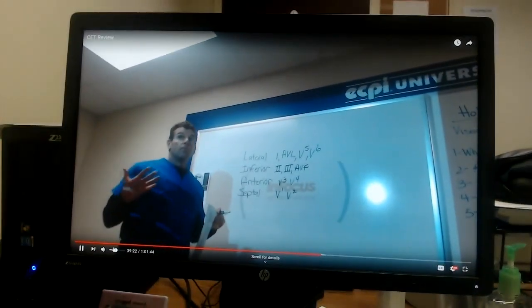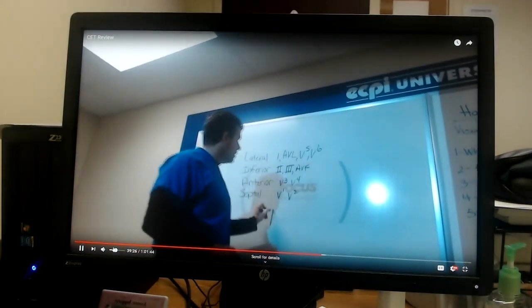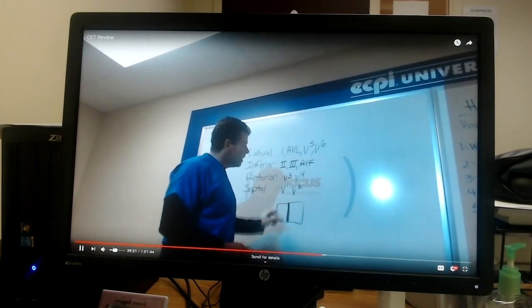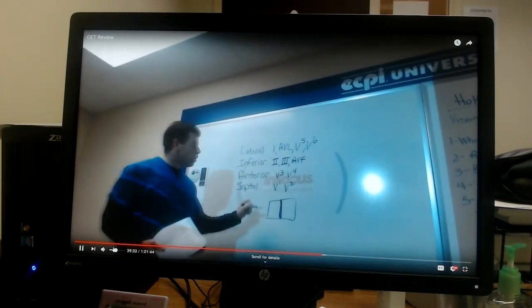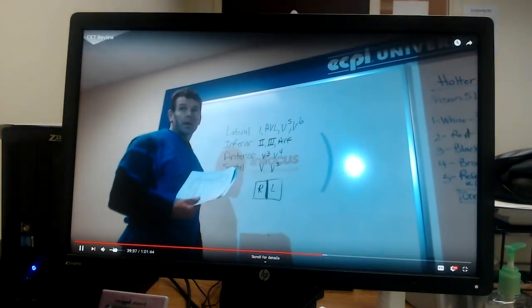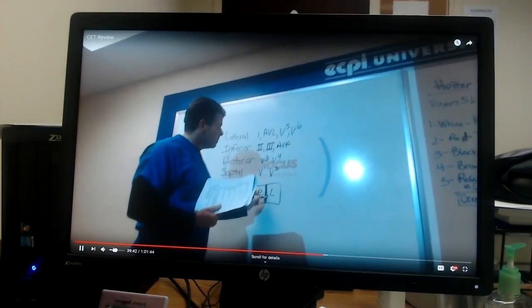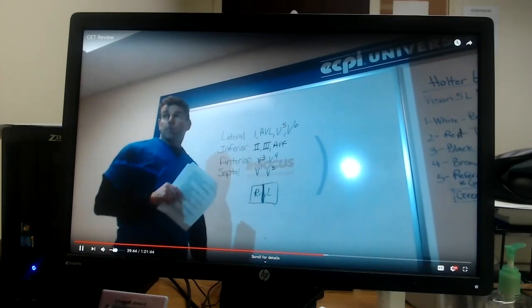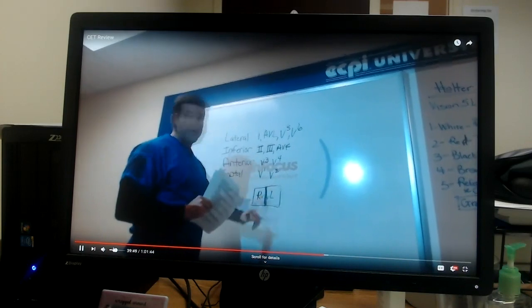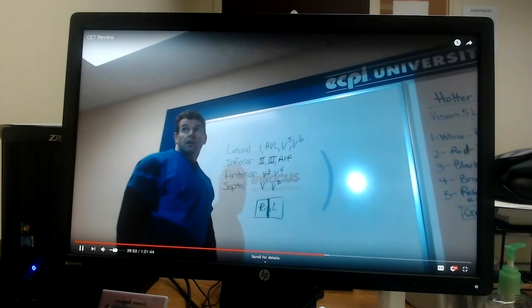But the septum is in the front of the heart, so to say. If we're looking at the heart, we know the septum is the muscular divider between the right side of the heart and the left side of the heart. Okay, and we've got V1 and V2. We do have some left anterior coverage out of V2.